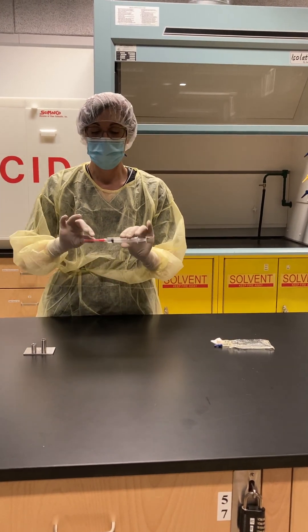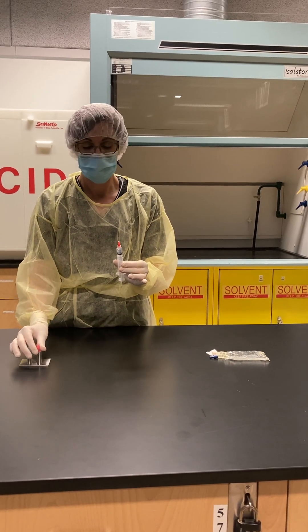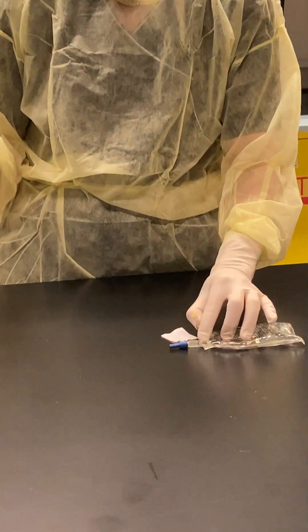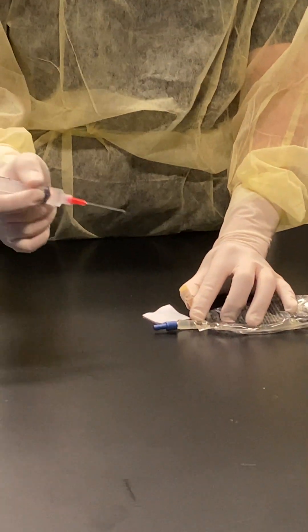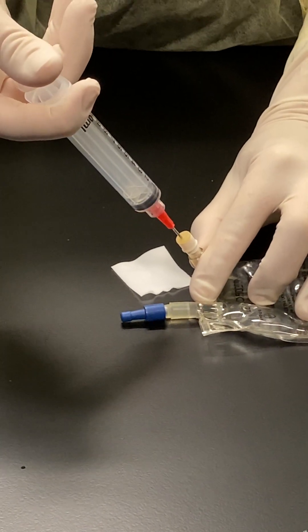Now that it's dry, I'm going to remove my needle cap off my blunt needle, lift my critical site — which is the port — into the air, and just push in.